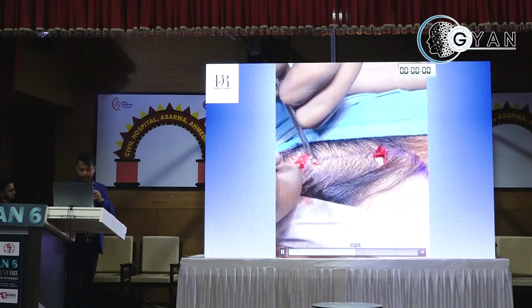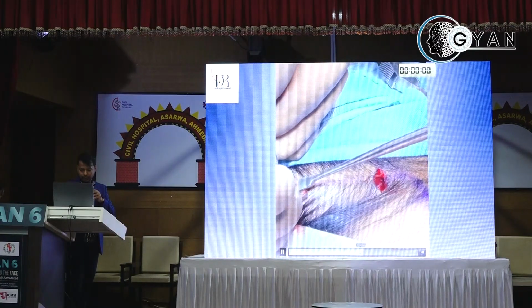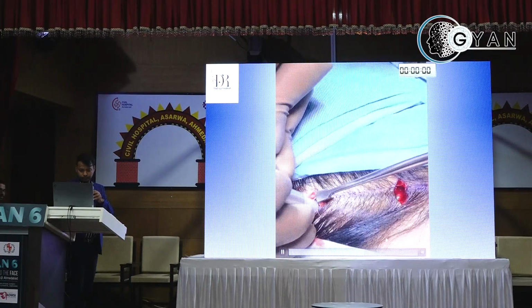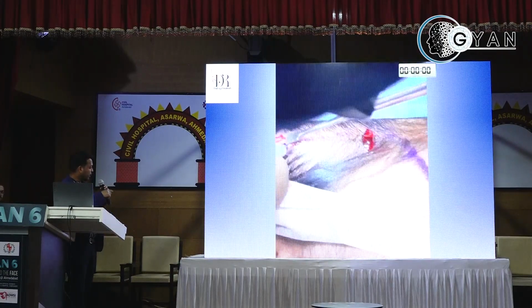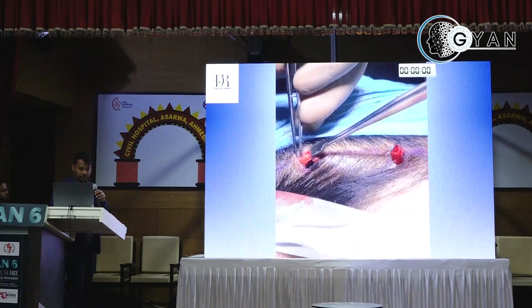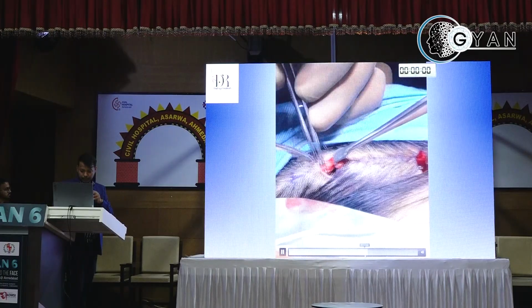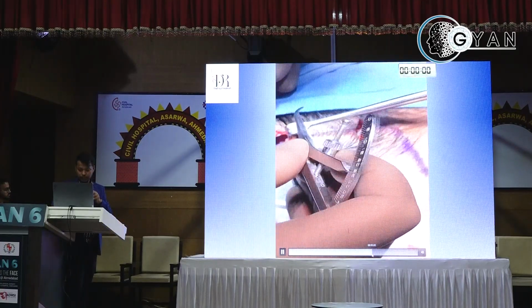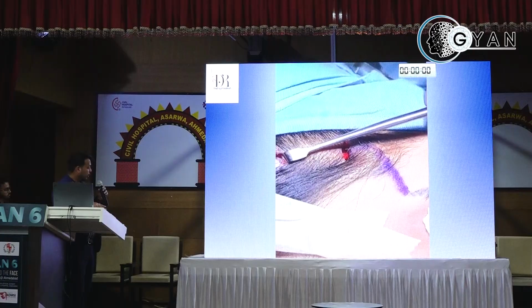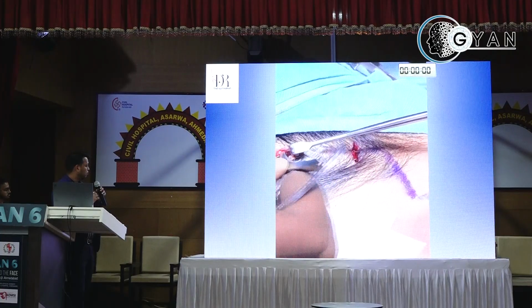Once we do it, we take an endoscope to see and give the markings. So in direct vision, we mark the lateral side and the medial side, and the other borders we mark with the endoscope assistance. This is a 2.5 centimeter width, and the length is 4.5 centimeters of temporalis fascia.